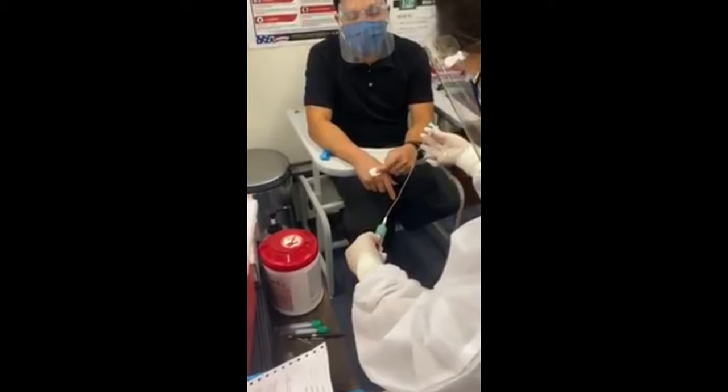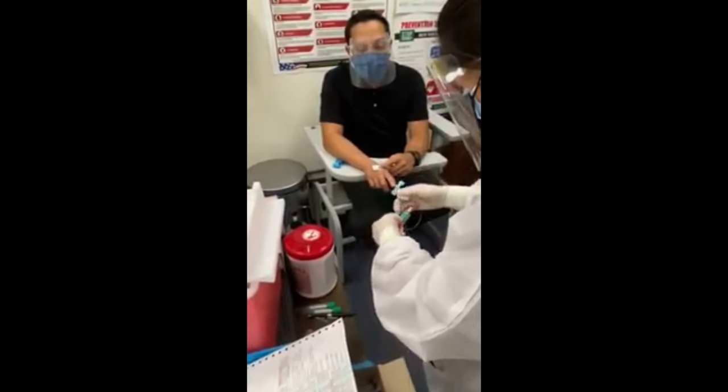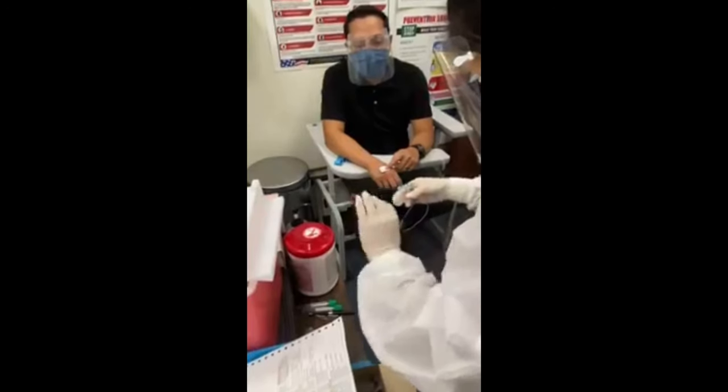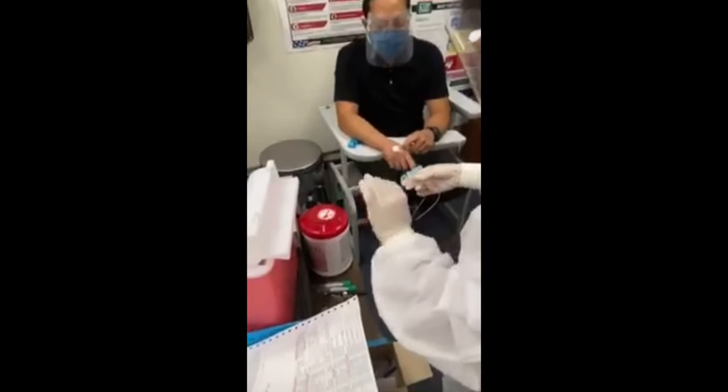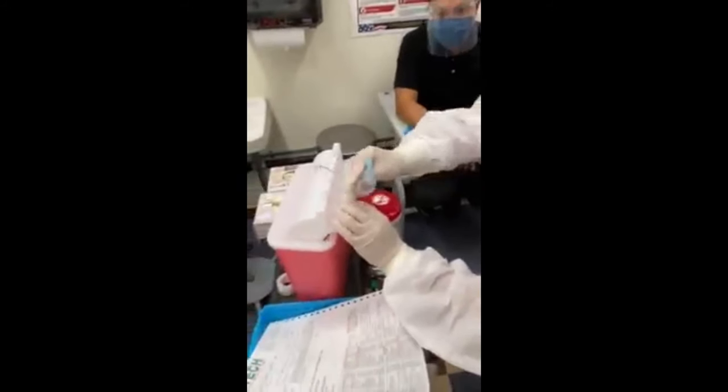Yeah, there's enough vacuum. So if there's blood in the line, you can actually reinsert the tube, and then you would just invert again. So you mix their blood with the additive in there. Okay, perfect. And then what would you do? Just continue whatever you're doing. So let me just dispose the needle. Nice.